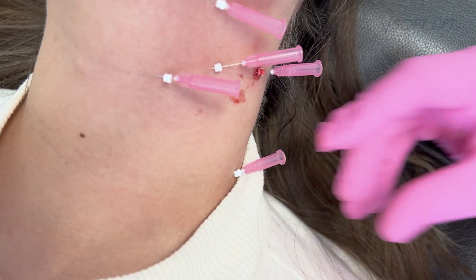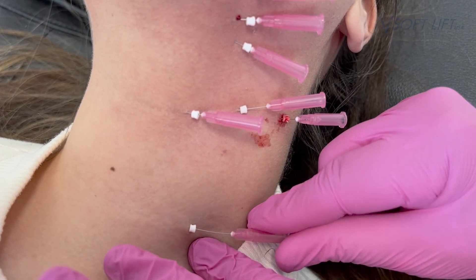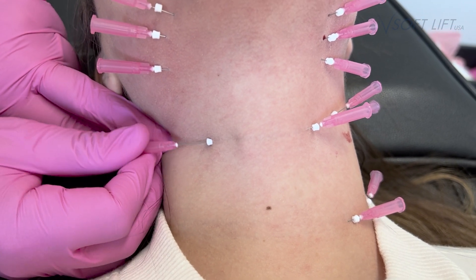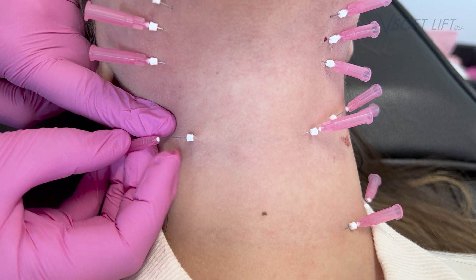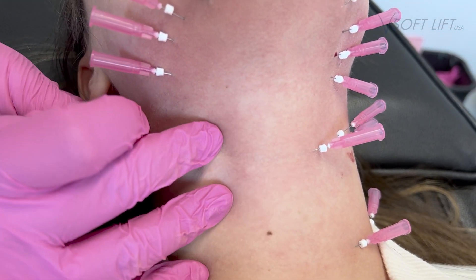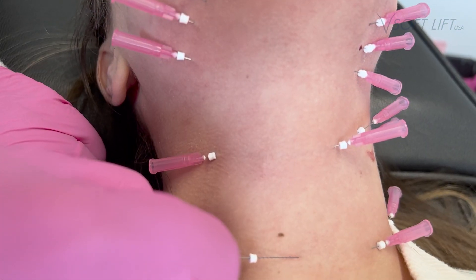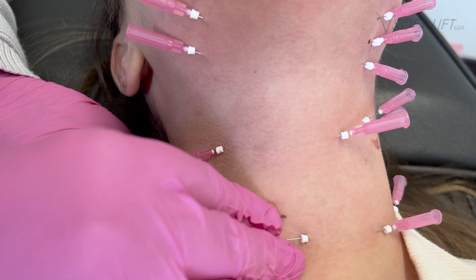In addition to the submental area, we're also treating her necklace lines, also known as tech neck. It results because we're always looking down at our phones, at our screens, and we form these static creases over time. A lot of patients come in wanting them addressed. I like to use PDO threads here because it's stimulating our body to do what it should be doing anyway — stimulating collagen and elastin — and this tends to give you a very nice, natural result.